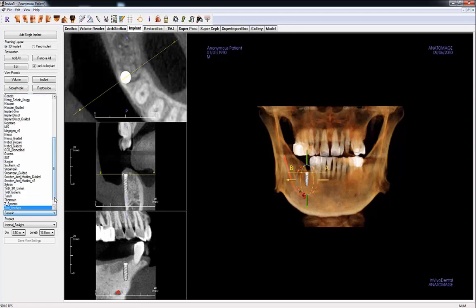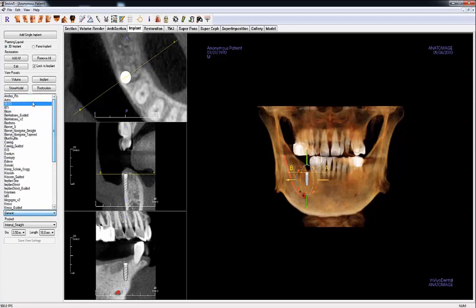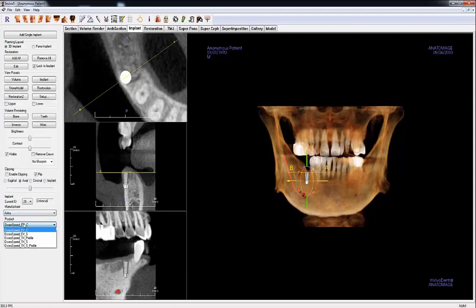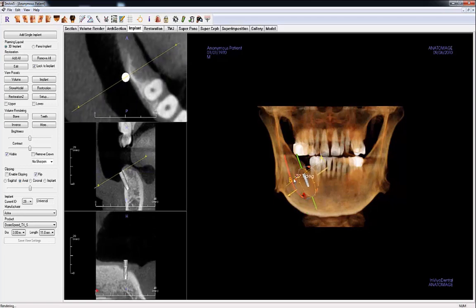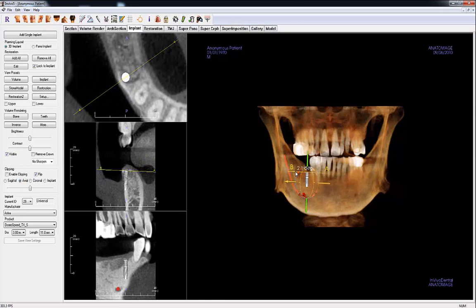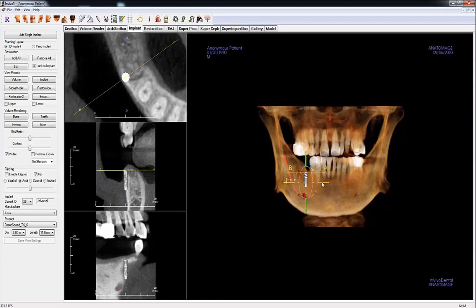In the View Control, you can set the Manufacturer, Product, Diameter, and Length of the selected implant using the drop-down menus. With the implant selected in the volume, a widget will appear to adjust the implant.